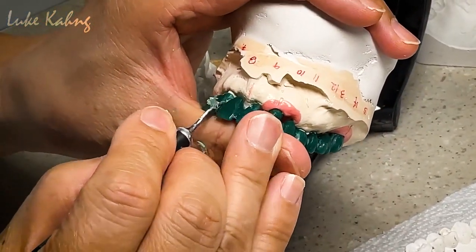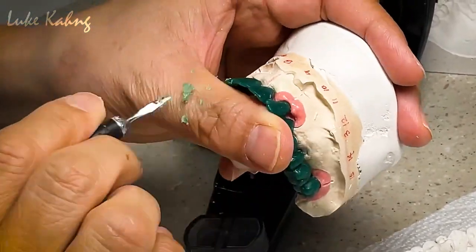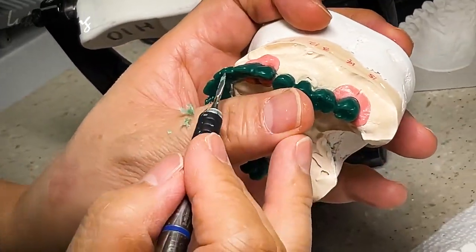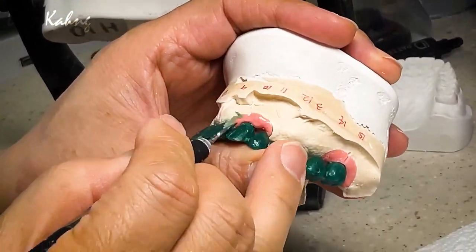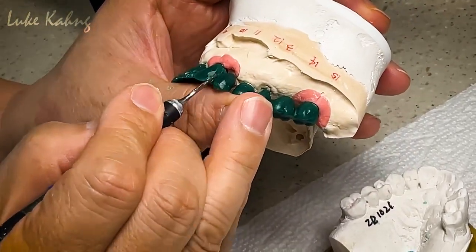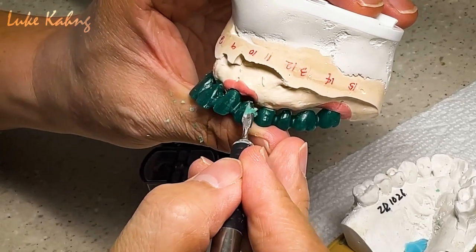I have to grind a little bit more. Here I have to bring it in to make a good alignment. Same thing here — just a little bit. Make sure the contacts have them a little bit more touching — that is better.